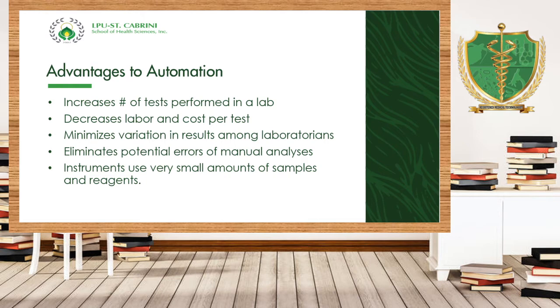That's one of the justifications of a laboratory manager who made a request in the past, during my visit to our interns. He said, sir, I decided to decline the use of an automated analyzer in clinical microscopy because my medtechs will become dependent. They will forget how an RBC looks like in the urine. They will forget how CaOx looks like under the microscope.